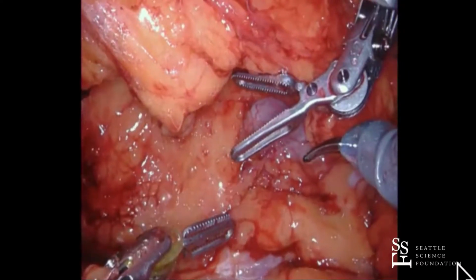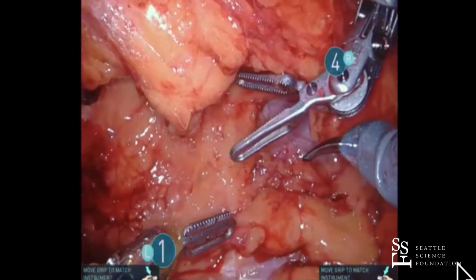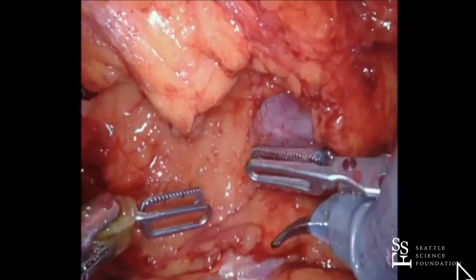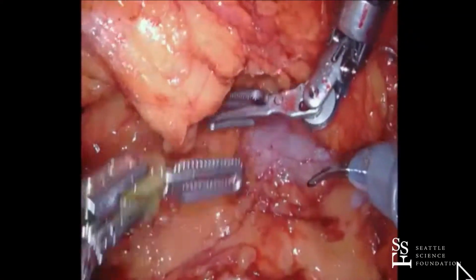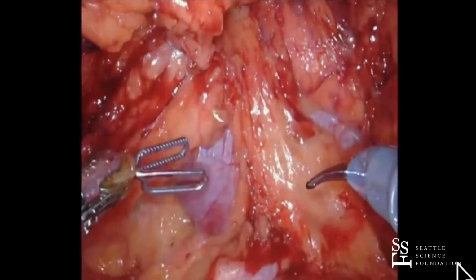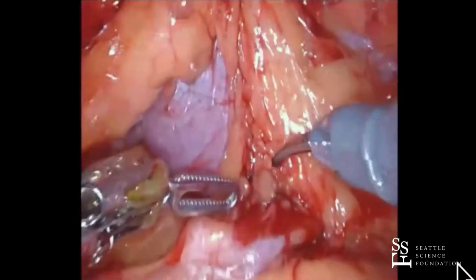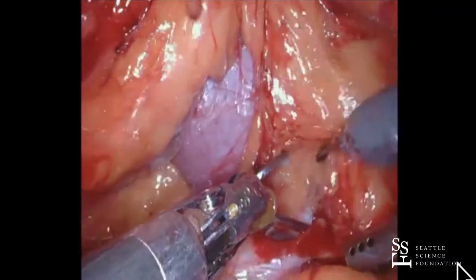So there's a function on the Xi arms you guys might be familiar with, but it's very important right now. It's called clearance and reach. It's a combination of, well, one or the other. Reach allows you to go backwards. The arms kind of pull themselves out of their own way. It feels a little better. So see what the fourth arm is doing for him, how it's lifting up the kidney and pulling it away so that he can get to the hilum. That's what you don't have if you don't have the fourth arm in.